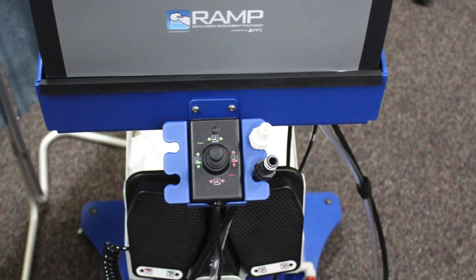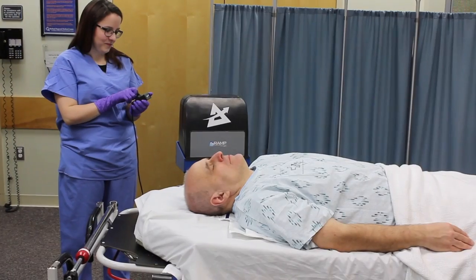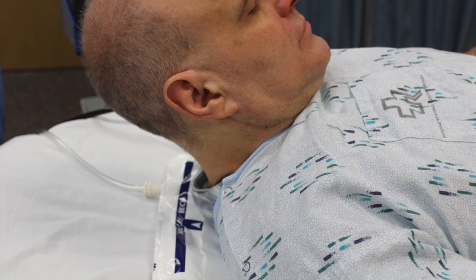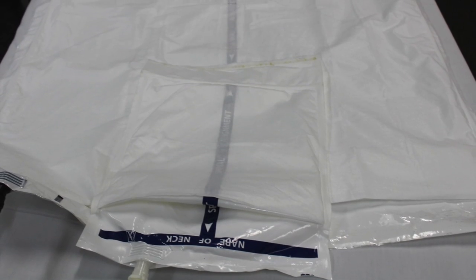To initiate use of the ramp, locate the top of the patient's shoulder blades on the deflated ramp in the area that states 'nape of neck,' and center the patient's head on the T mark printed on the smaller air chamber.